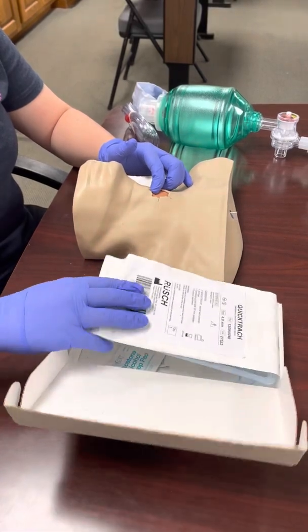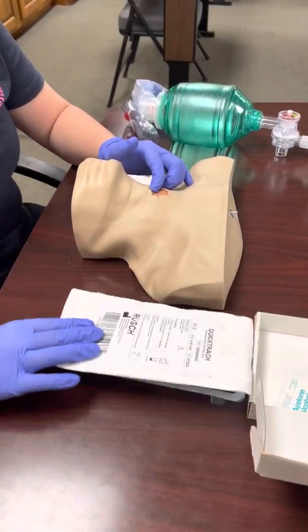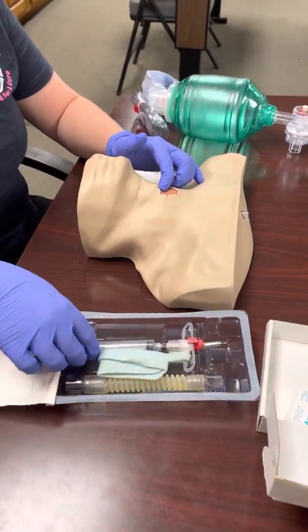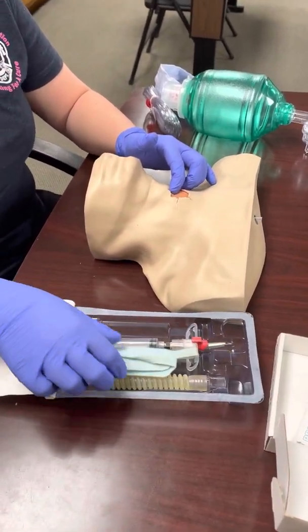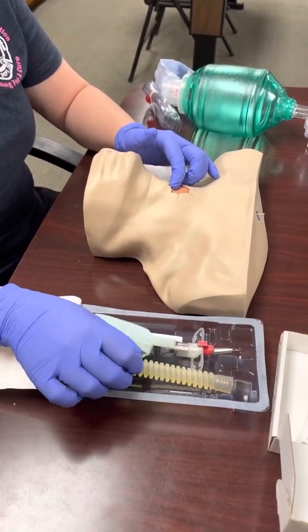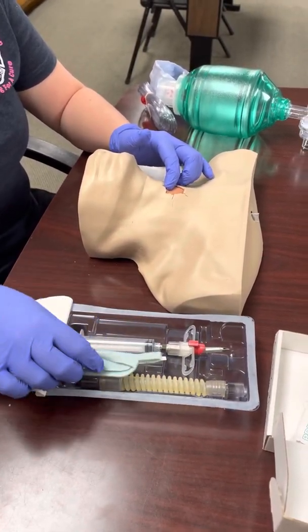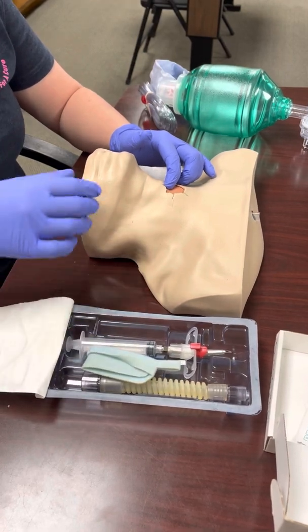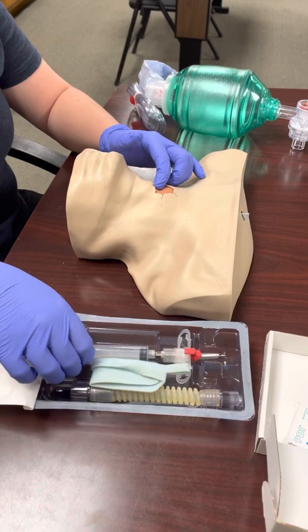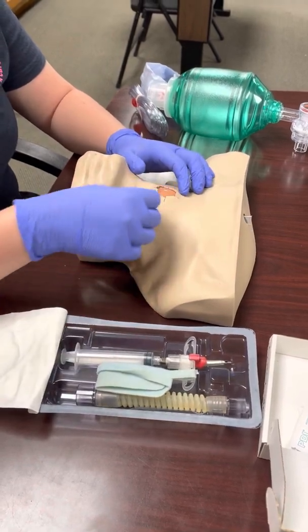Inside your Quick Trach kit you'll have your cleaning agent — this one has alcohol prep pads — and when you open your kit you'll have your introducer, your securing strap, and your adapter, which connects to the bag and gives you a little more wiggle room with the BVM. Once we've found our spot, we're going to cleanse the area.